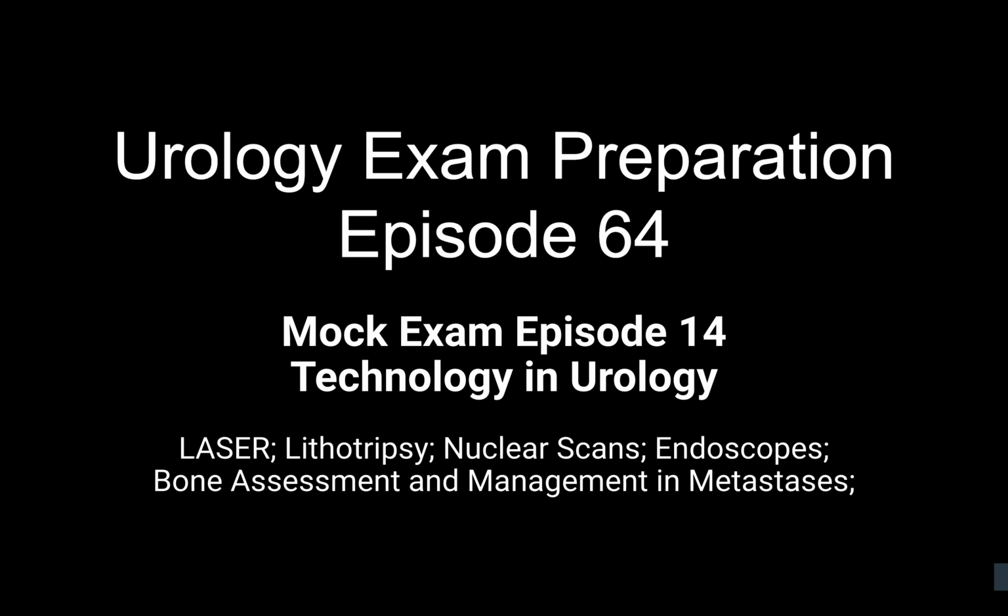Is there any advantage if you have the ability to change the pulse duration? Yes, if we shorten the pulse duration, then we'll be able to deliver more energy in a shorter period of time. Okay, good. And what other lasers can be used for stones? Are you aware of any other lasers?